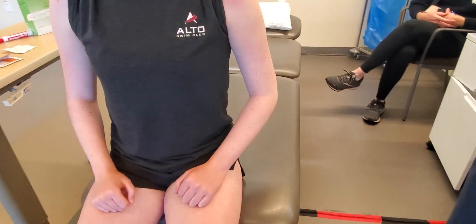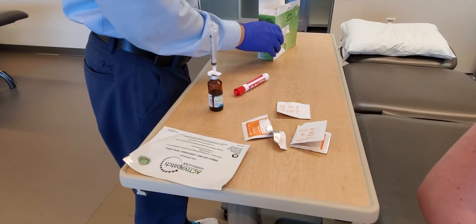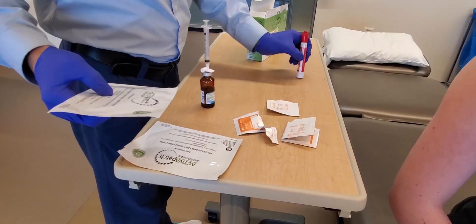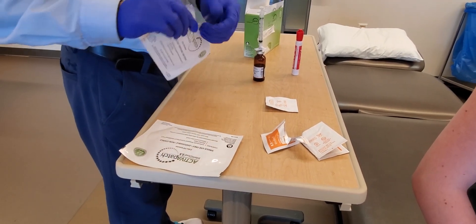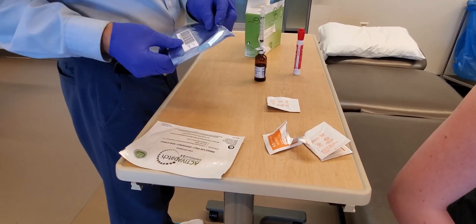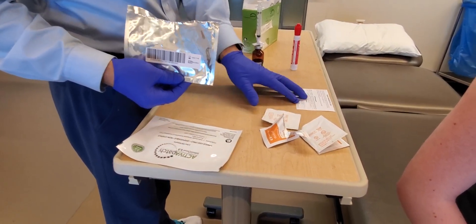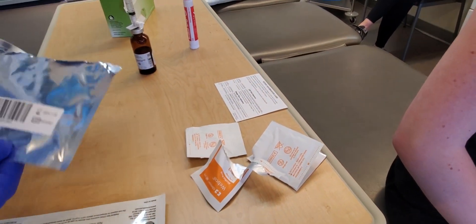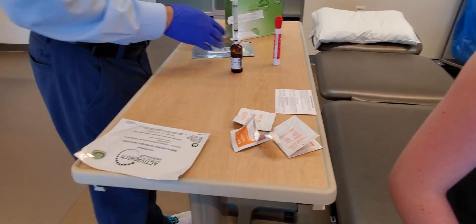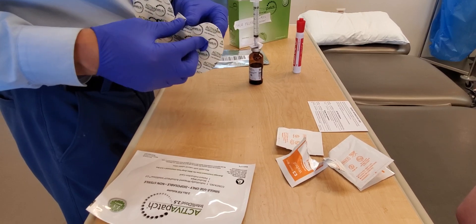The tissue is prepped. Because we have two shoulders, we need two patches. I'm only going to demonstrate one, but it would be the same exact steps for the subsequent one. Here's a little card that denotes the LED flashing sequence as well as the dosage timer so you can orient yourself to that, though for the purposes of this video it's not necessarily important at this moment.